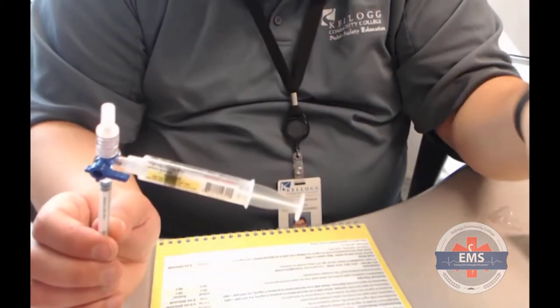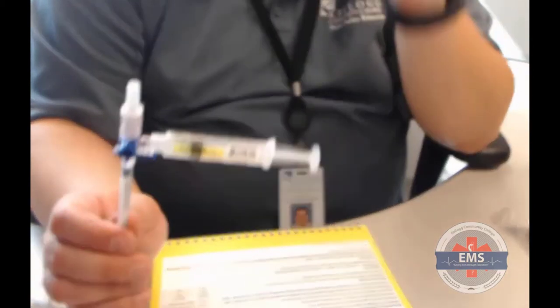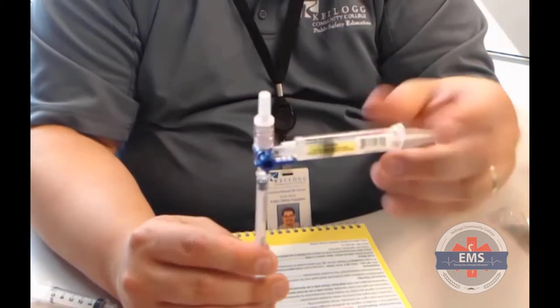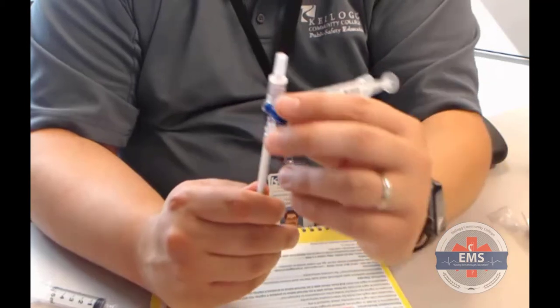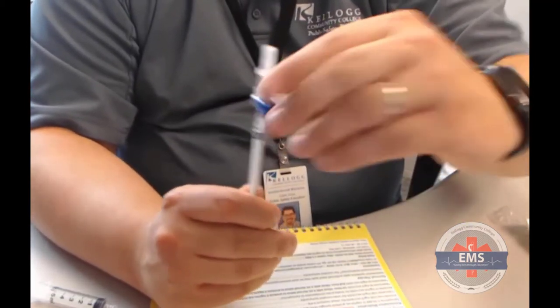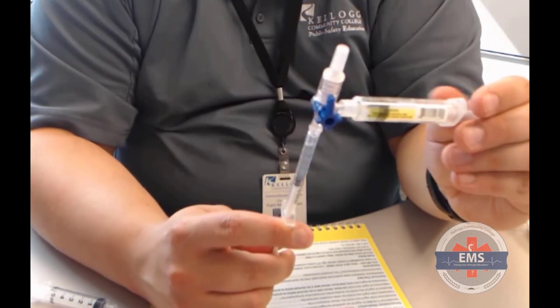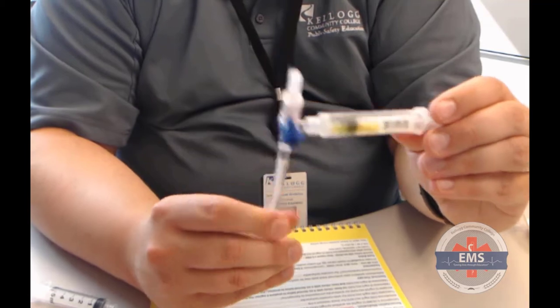Another one that you may consider would be epi. Epi is a very common one that you can see as well. And so you would again use your pre-filled epi syringe just like this, and then begin to draw up that medication just as you would normally. Again, make sure that you continuously move that stopcock back to the off and on position as you draw out more medications as necessary. So hopefully this is pretty helpful.